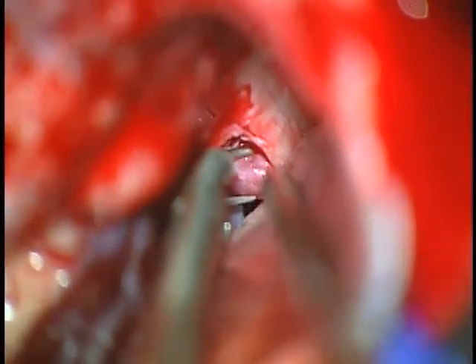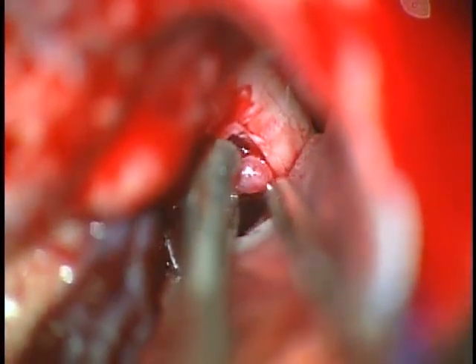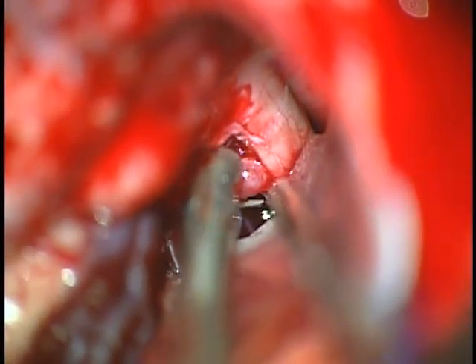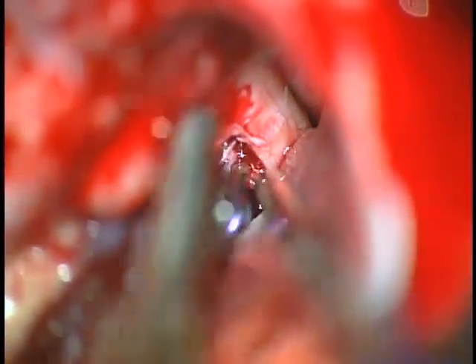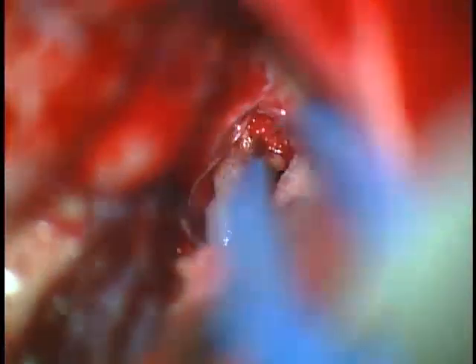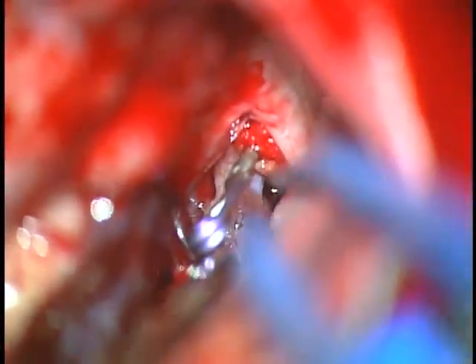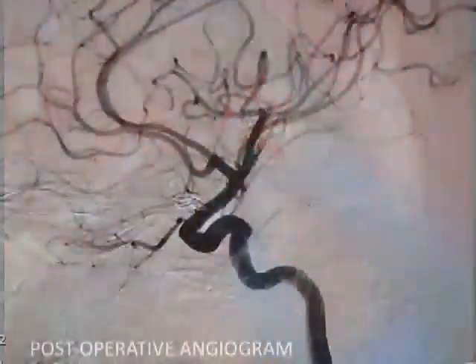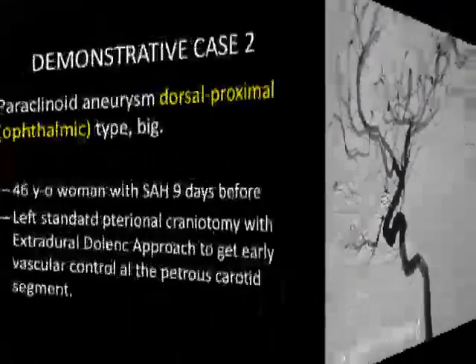Using a titanium Yasargil mini clip, the neck of the aneurysm is completely obliterated. A small piece of sponge is positioned between the nerve and the clip to avoid any damage to the nerve. The postoperative angiogram shows total occlusion of the aneurysm.